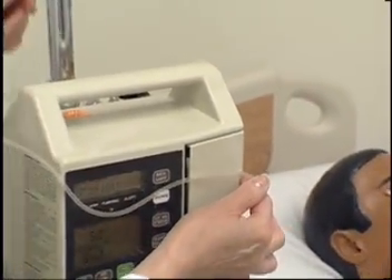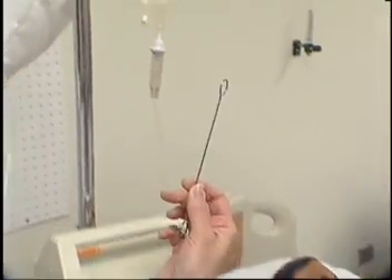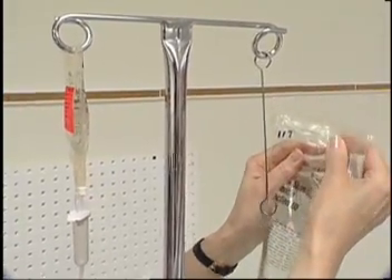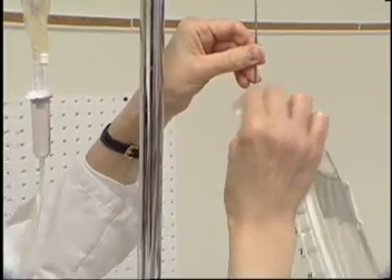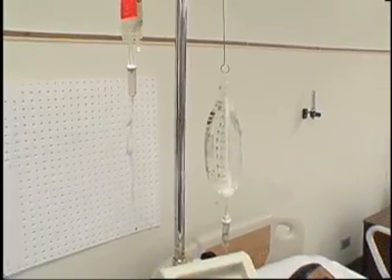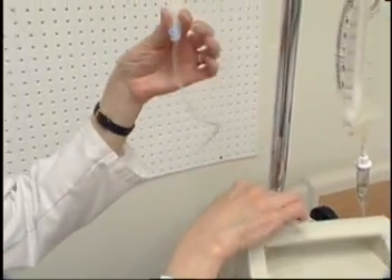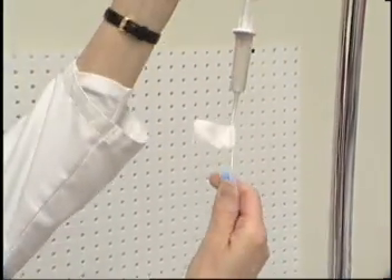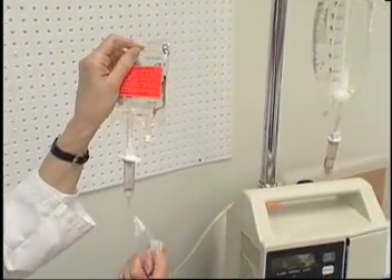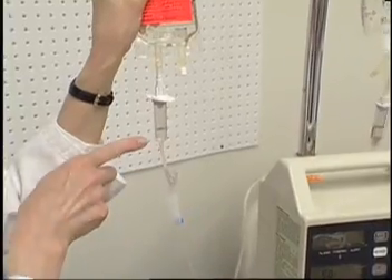Use the extension hook to lower the primary bag below the secondary bag. Prime the tubing of the medication bag by opening the clamp and placing the bag lower than the primary solution, allowing the primary solution to flow into the secondary bag tubing. Backfill until the secondary tubing chamber is one-third full.